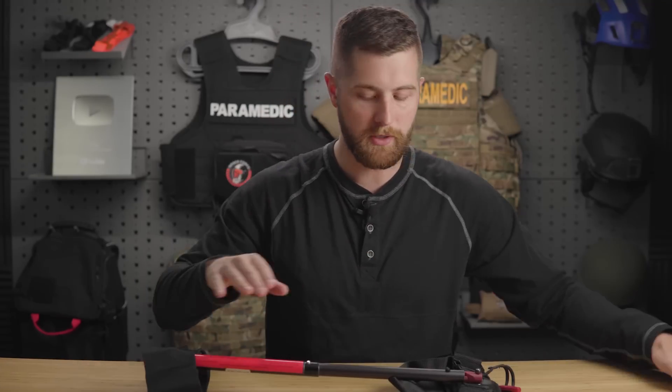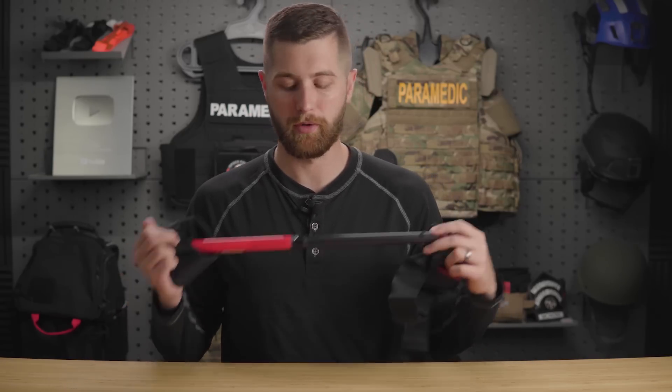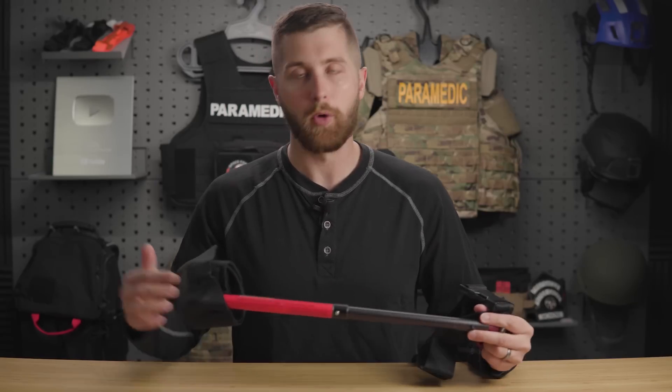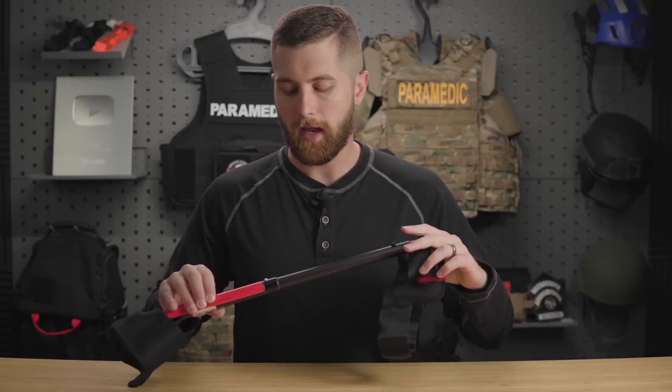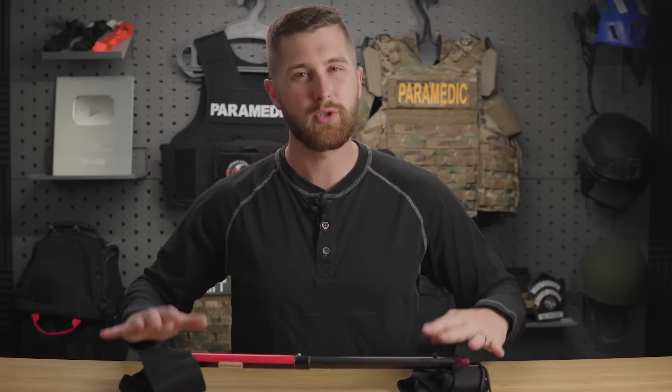All in all, this thing is super easy to apply. They advertise that it can be applied in under 60 seconds — I would argue almost any traction splint can be if you train well enough. However, this is exceptionally easy to use and there's just nothing to put together. You don't even really need to measure it, which is a game changer we haven't seen in other traction splints. Main advantages are super lightweight, super compact, and easy to apply. It also doesn't stick out past the leg, which matters in a helicopter where you don't have much room. The Sager, Hare, and even the KTD do not fit in an aircraft and you have to jury-rig things — this will fit in an aircraft just fine.